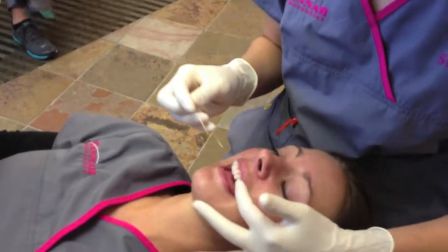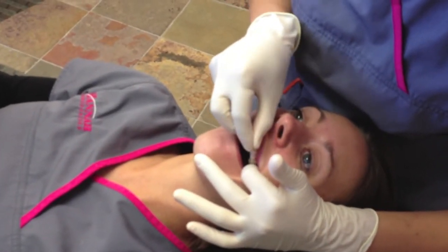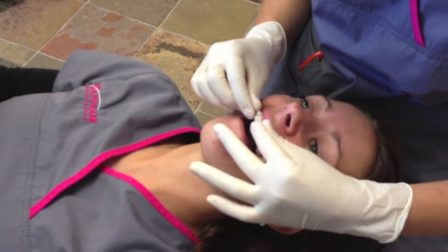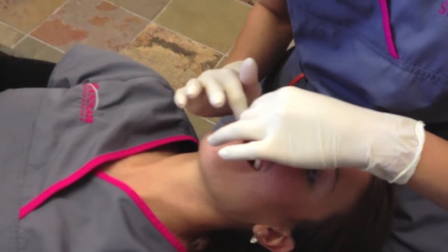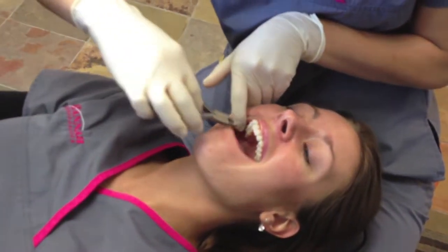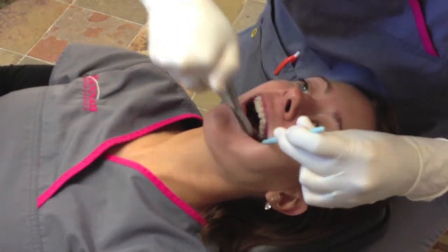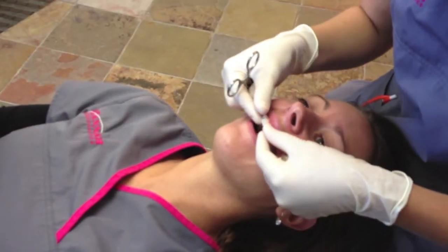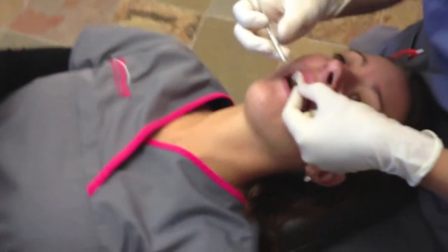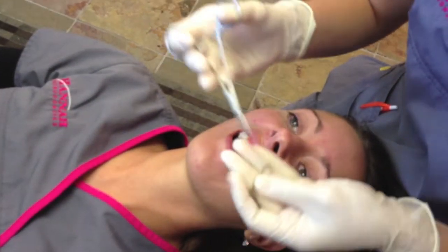Wire time. This just slides right through the back slot. Sometimes it's a little pokey going in because we don't know how much we need at first. I'm just gonna go ahead and put our little ties on here. These little ties just go right around the bracket to hold the wire in.